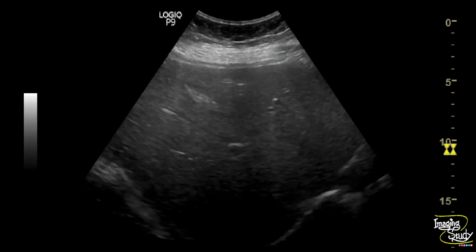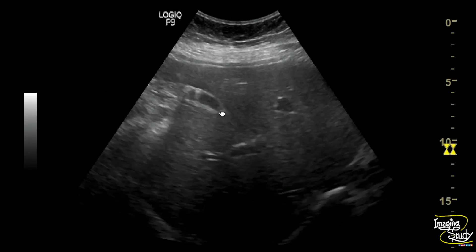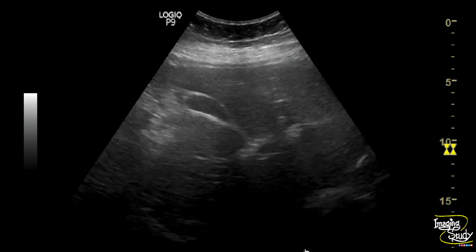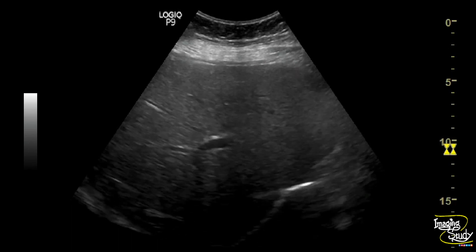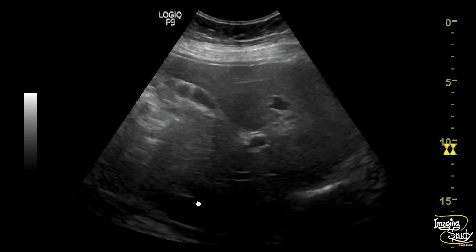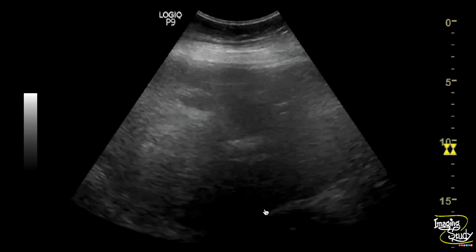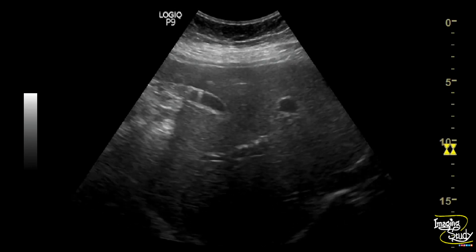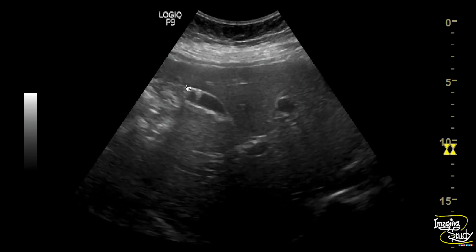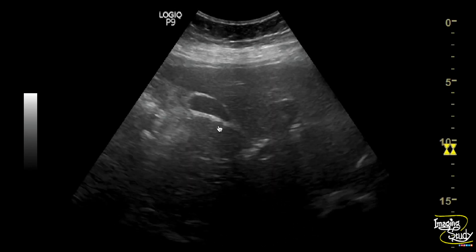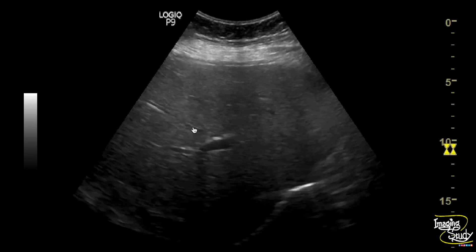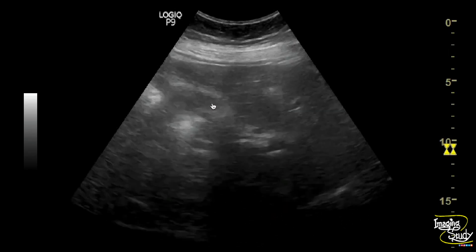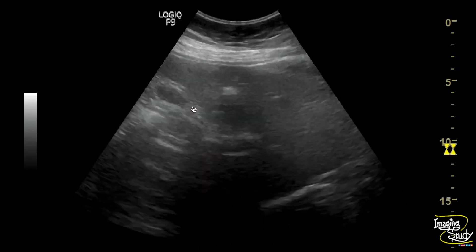Here you can see the part of liver and gallbladder. The overall hepatic parenchymal echogenicity is increased due to mild hepatic steatosis, and you can see the posterior sound attenuation due to this fat deposition. If you look at the gallbladder, it is contracted, possibly due to the postprandial state.